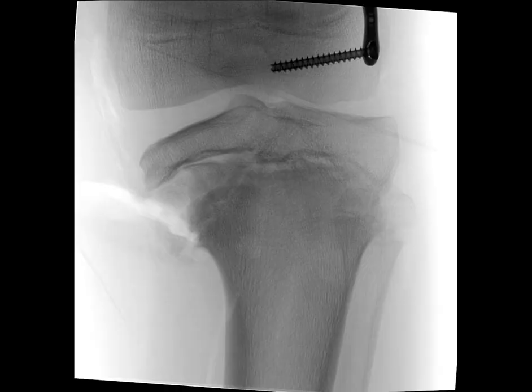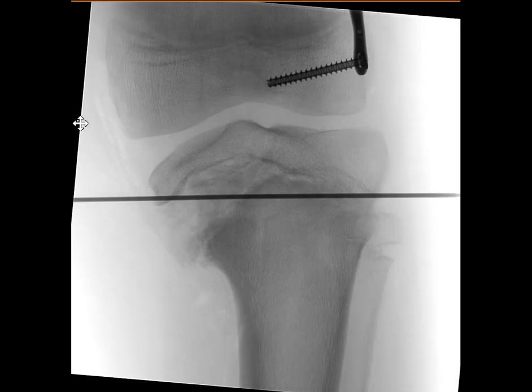After the epiphysiodesis is completed, it is time to put the bone graft to prevent the collapse of the hemiplateau. Usually the bone graft can be a snug fit and you cannot remove it, which is great. However, sometimes it can be loose and needs some sort of stabilization. There are different ways to do the stabilization. One way is to use cannulated screws, however these can come in the way of your half pins later for the frame. Or we can use the same fine wires for the frame to do the initial stabilization, which is my preferred way.